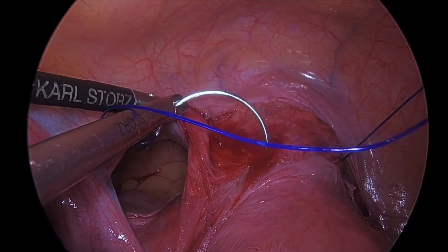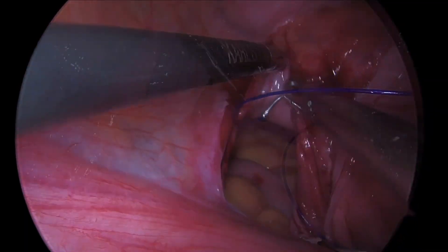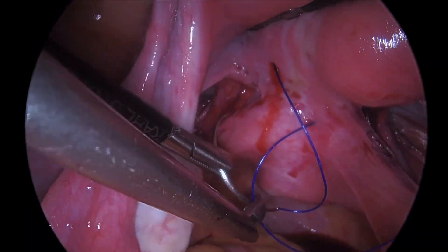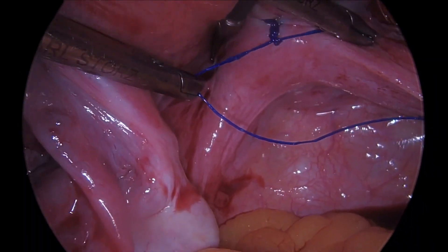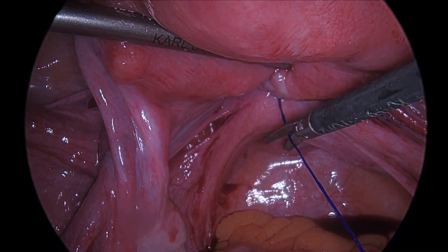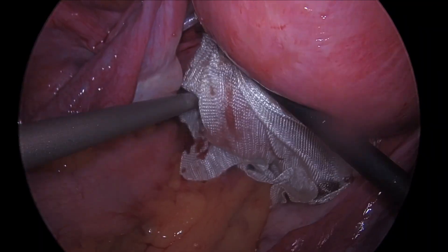Care must be taken to pass the suture medial to the uterine vessels without passing through the canal of the cervix. The suture is then passed anterior to posterior on the contralateral side using the previously marked locations at the level of the internal os. A uterine manipulator is helpful to antivert and retrovert the uterus to improve ease of passing the suture when placement is performed pre-conception. The suture is then tied intracorporeally with six knots at the posterior cervico-isthmic junction. Anti-adhesive barrier is placed at the location of the broad ligament windows to aid healing and prevent adhesion formation and bowel herniation.